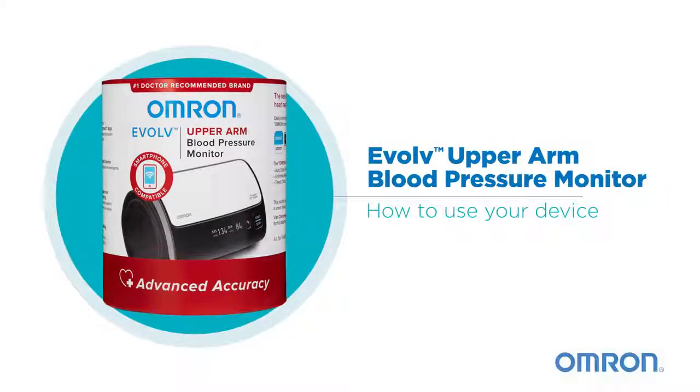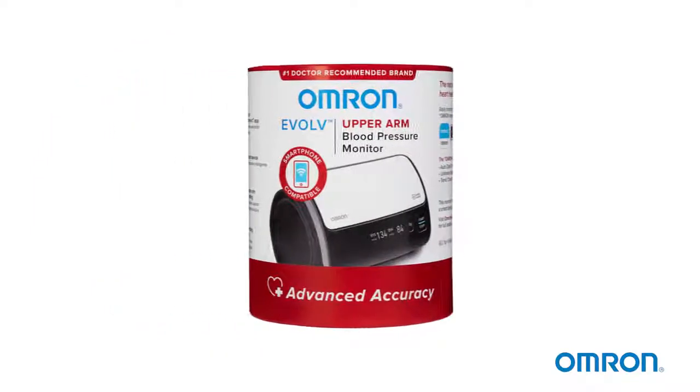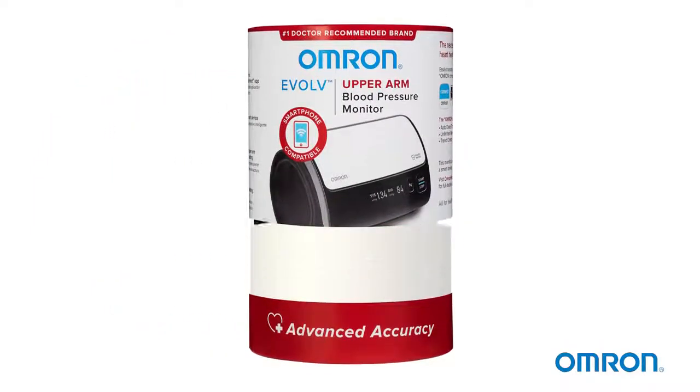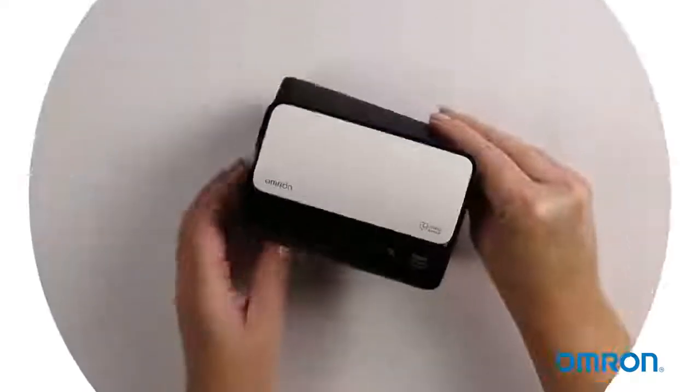Omron's new Evolve upper arm monitor makes it easy to take your blood pressure anywhere, anytime. Its compact, sleek design has no tubes or wires, so it's highly portable and easy to use.